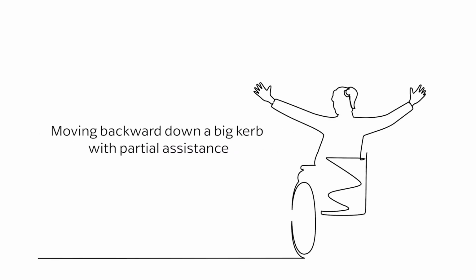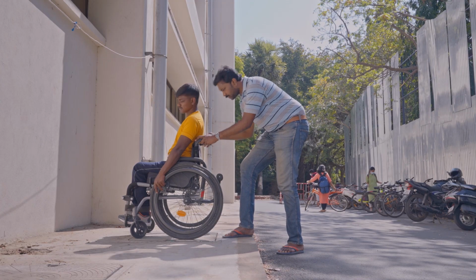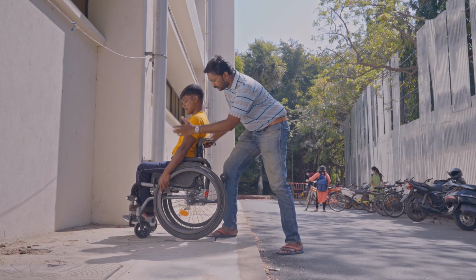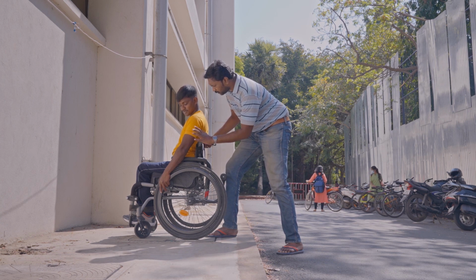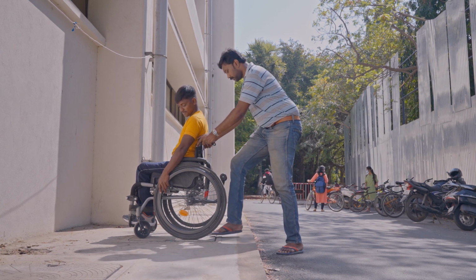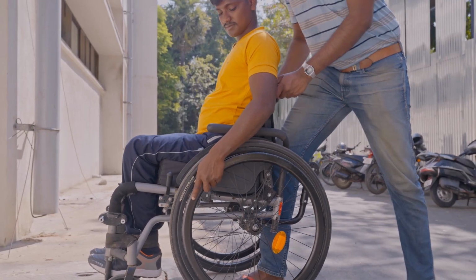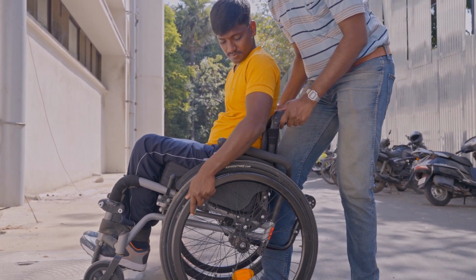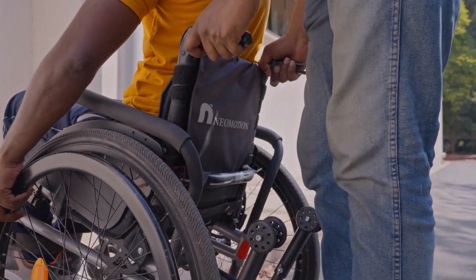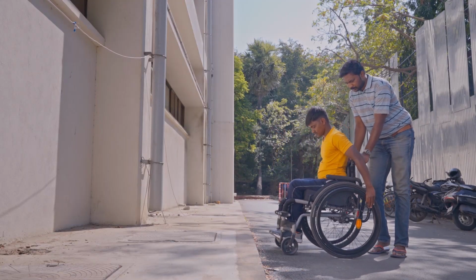Moving backward down a big kerb with partial assistance. To move down a big kerb backwards with partial assistance, begin with your back facing the kerb and an assistant standing behind you. Pull the wheelchair backwards. When the rear wheels touch the edge of the kerb, the assistant should gently lower the rear wheels. Now pull back on the push rims to move back and gently drop the casters.